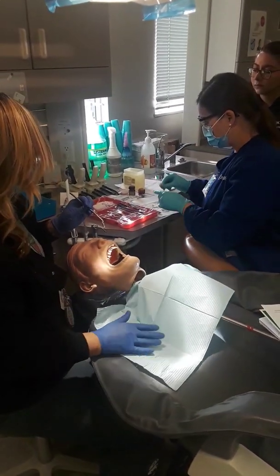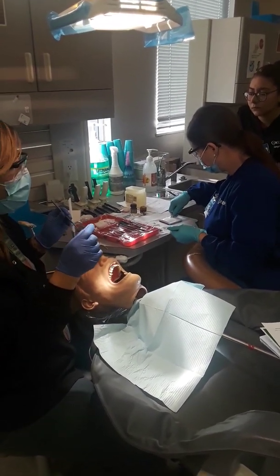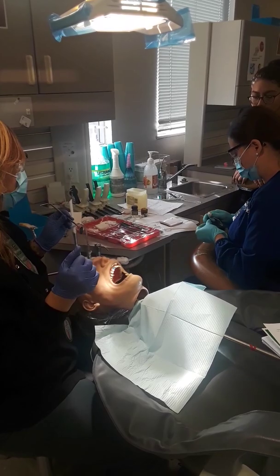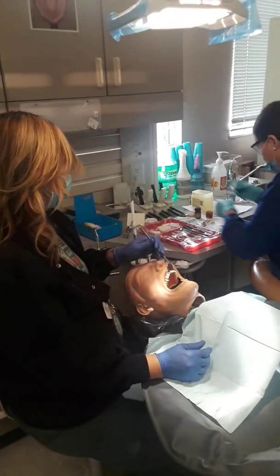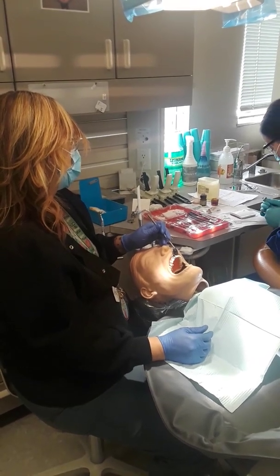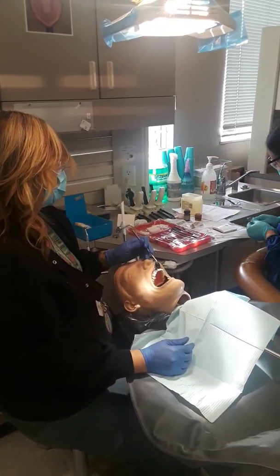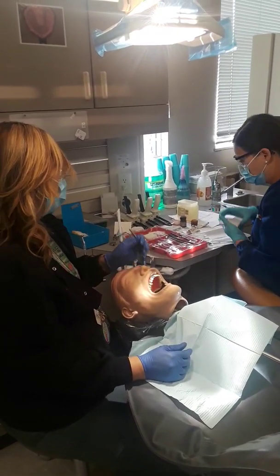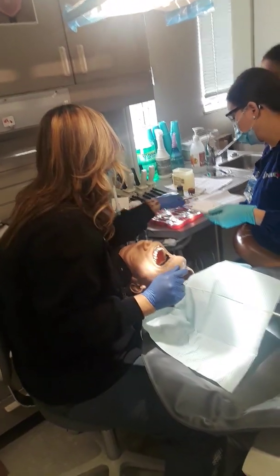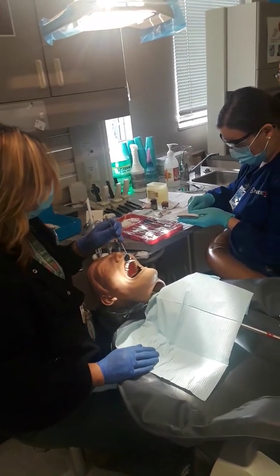Okay, so when I first cement, to mix temporary cement it's equal parts, so the same size diameter or squeeze. Patient stay open. So it looks like this. We have a catalyst and a base, and then she's going to mix it together. Oh no, use your Woodson. Make sure we get a spatula.